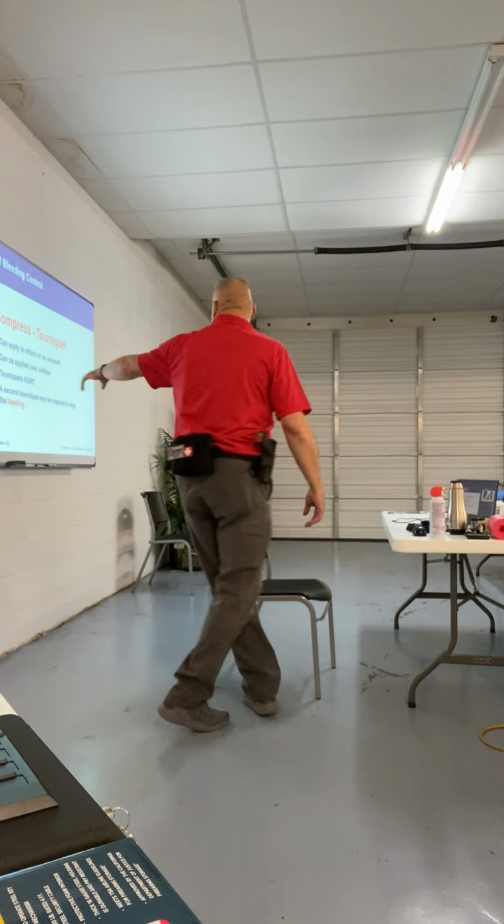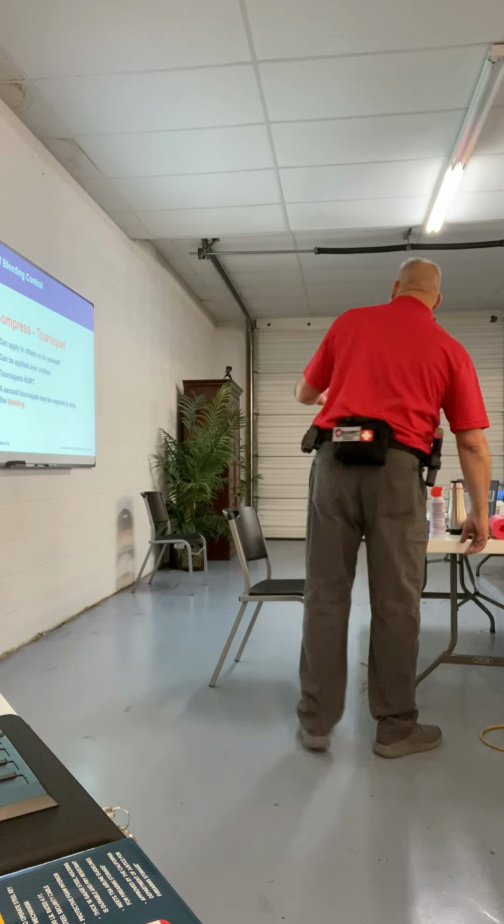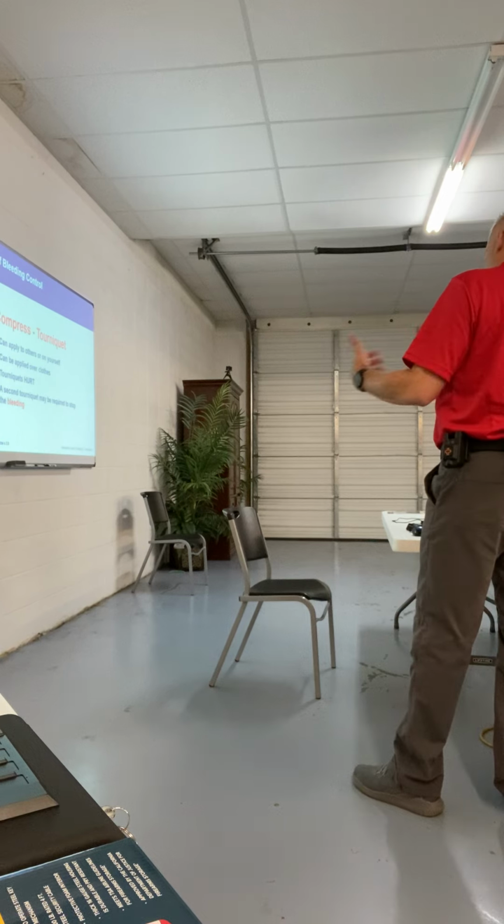So, oh yeah, hey look, tourniquet hurts. Did y'all hear that somewhere else before? The tourniquet hurts. Y'all know it from doing it to yourselves. It can be applied over clothing. You don't have to remove clothing. You can go right over clothing.